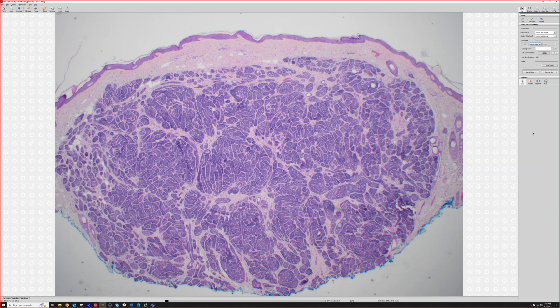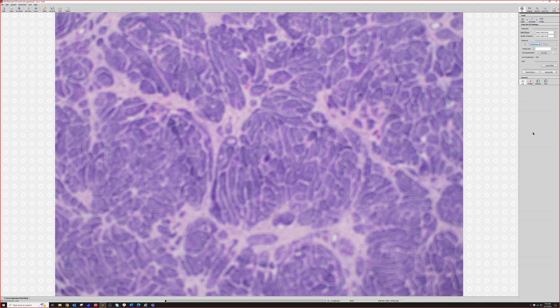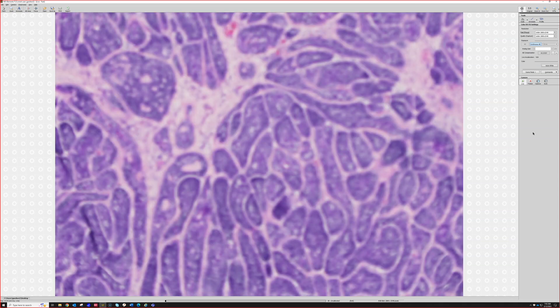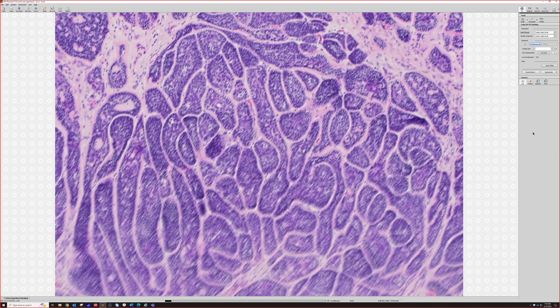...here, your nodule is made of multiple little nests all packed together with irregular shapes, but kind of squished into each other, molded together. Some people say like puzzle pieces or spots on a giraffe, but they're all squished together.